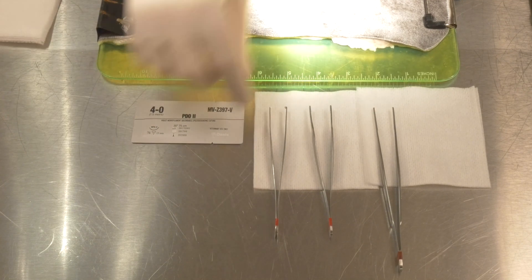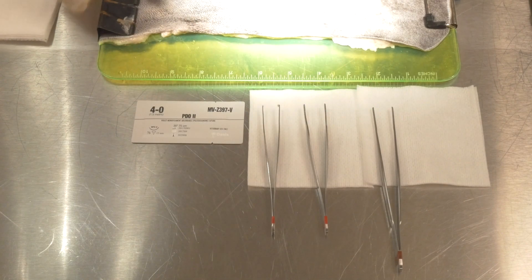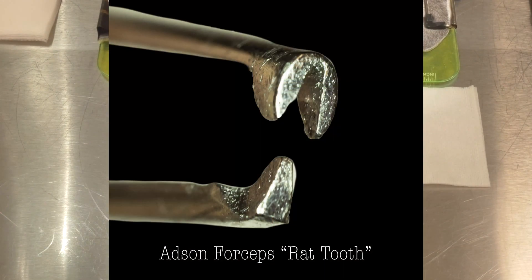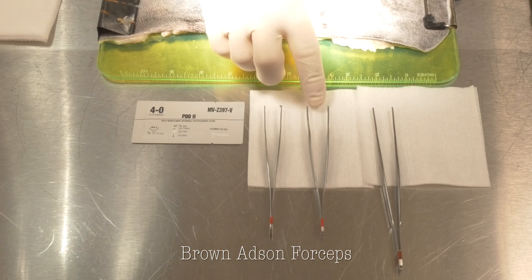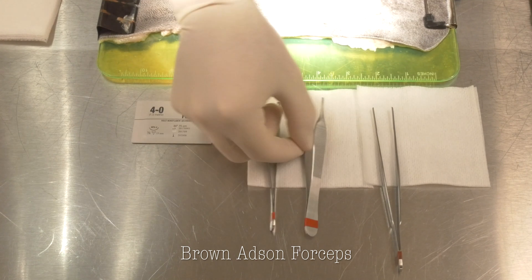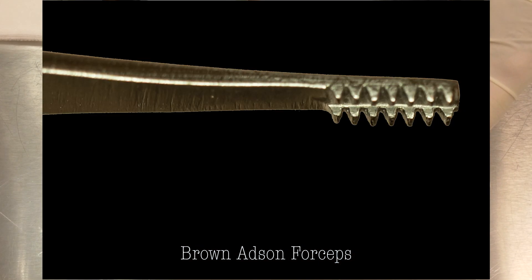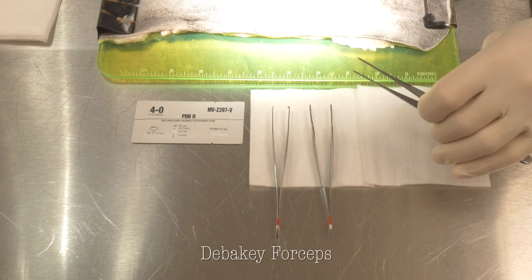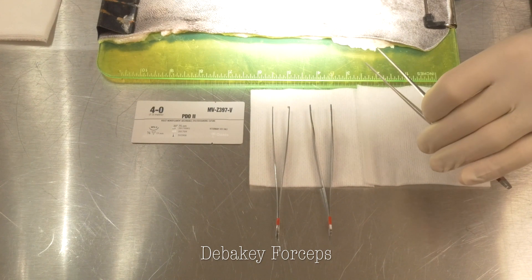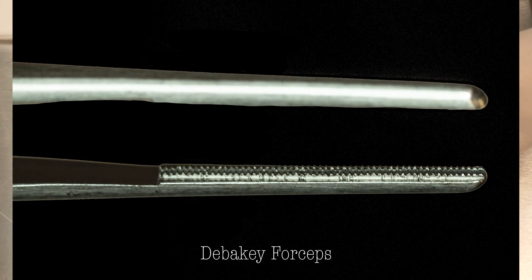We have a couple different instruments we can use when handling tissue. Our rat tooth forceps, which are commonly called our Adson forceps. We then have our Brown Adson forceps that have a smaller area with teeth that are slightly smaller — less traumatic, but with a little bit more of a crush to them. And then the most gentle of all, the DeBakey forceps, designed for bowel handling originally, with small teeth spaced longer along the length of the forcep.